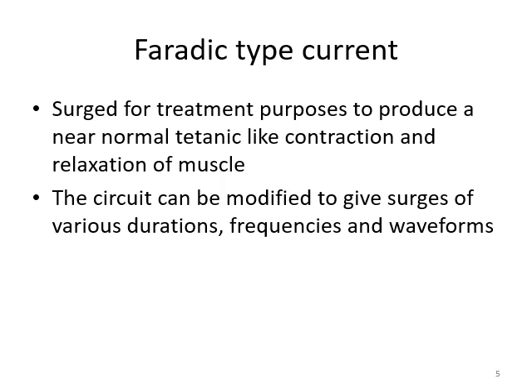Surging of the current in Faradic type stimulation produces a near normal tetanic like contraction as compared to the twitch-like contraction which is produced in the galvanic type stimulators. And the circuit can be modified to give different modulations in the format of duration modulation, frequency modulation, and waveform modulation in the surge Faradic stimulation.